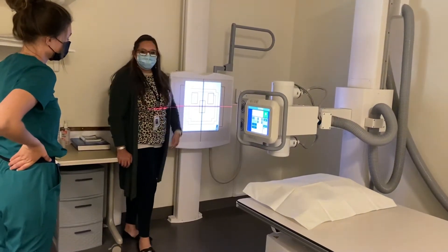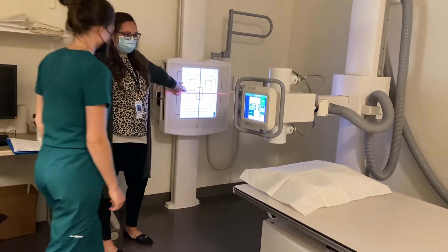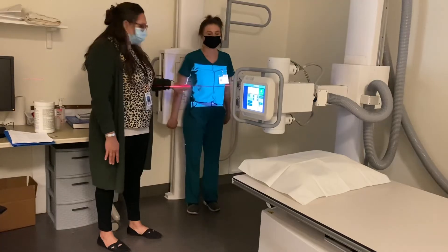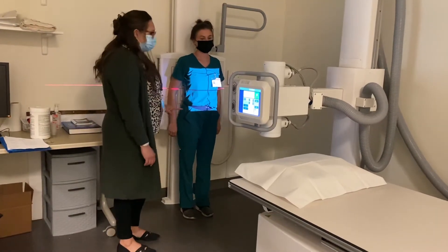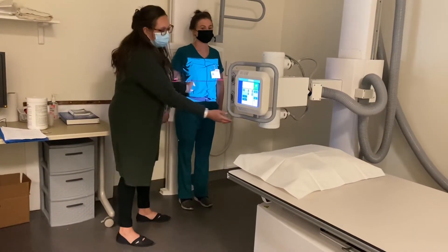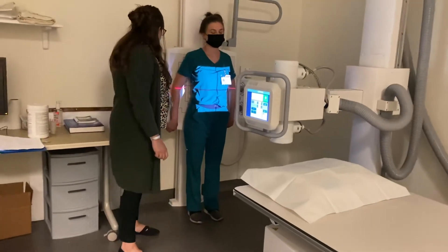I'm going to have my patient come in and they're going to stand their back up against this board for me. I'm not going to shield on this because the shielding would obscure the anatomy that we're trying to look at. So what I want to do is find my patient's iliac crest — I'm going to feel on your hips — and I want to go two inches above the level of the iliac crest so that I can include the diaphragm.